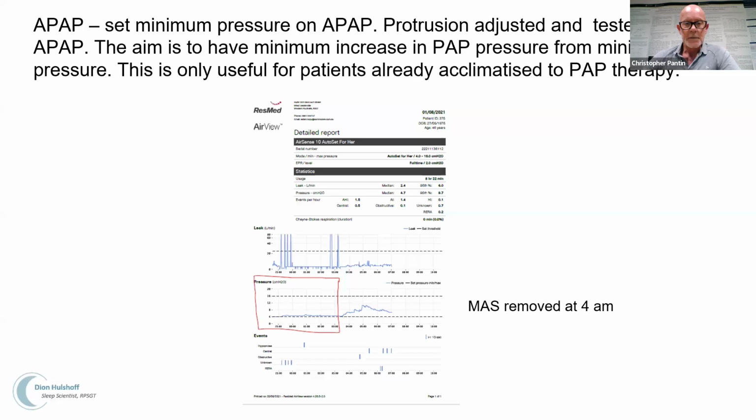Now, the more experienced people listening to this will say, yeah, but 4 centimeters of water pressure in a CPAP may be therapeutic for some people. And you say, well, yeah, you're right. But compared to nothing or partner report, it's a pretty robust way to measure if the splint's working.